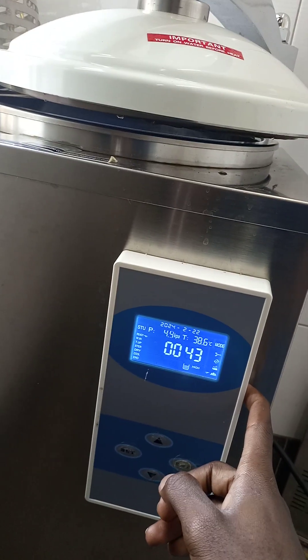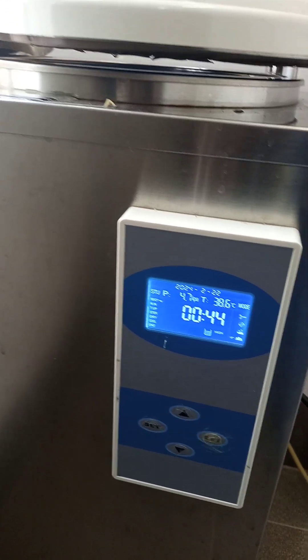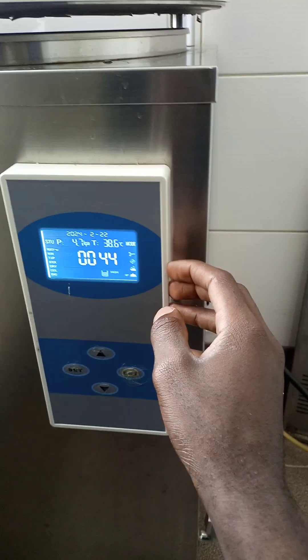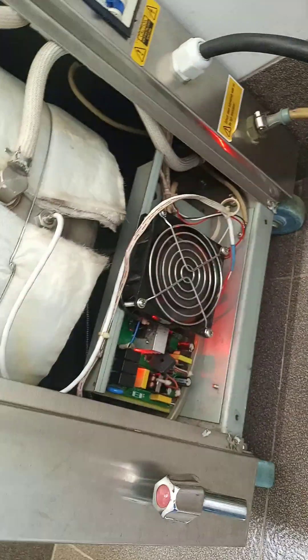So I thought the problem was with the water level sensors inside. I changed those and still the problem is not sorted.